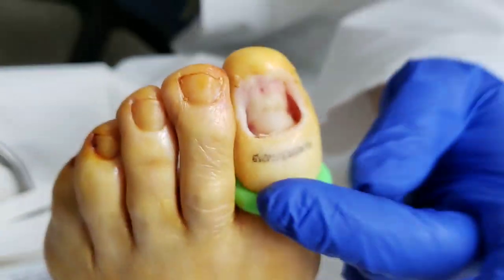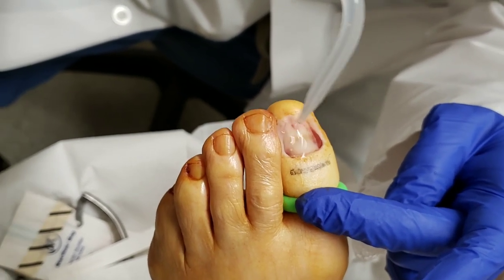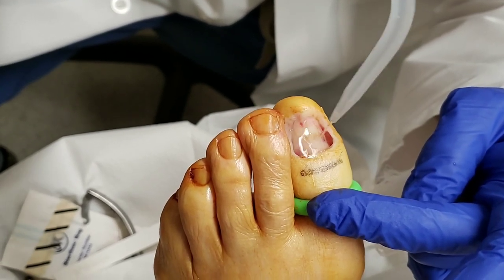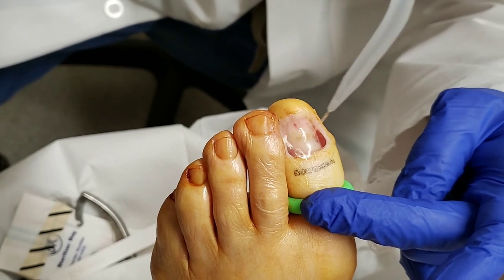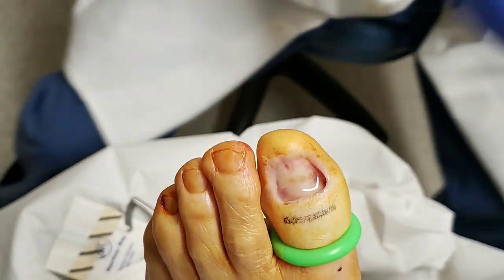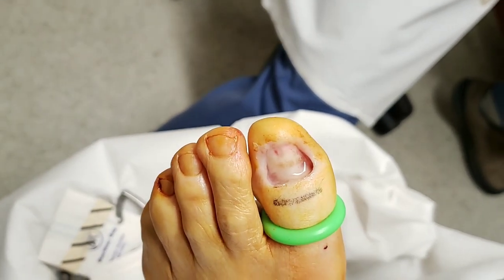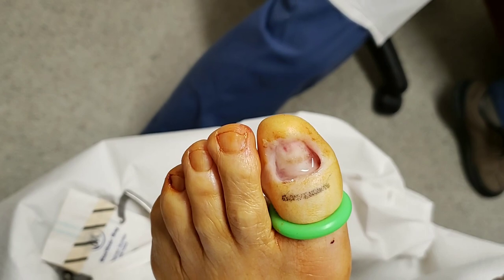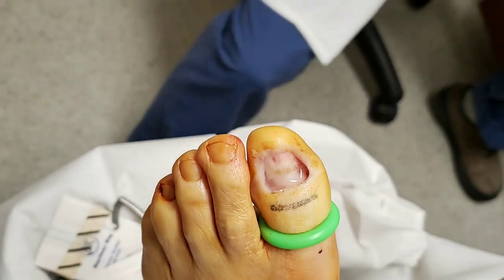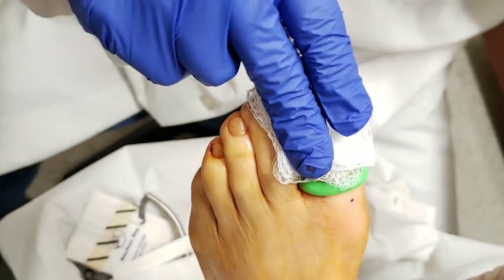And then what I do is I put a little vinegar to neutralize the sodium hydroxide. Then we're going to put a dressing on. It kind of smells like salad dressing because of the vinegar.